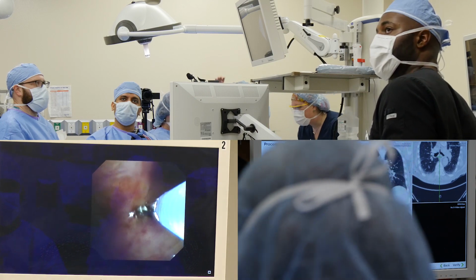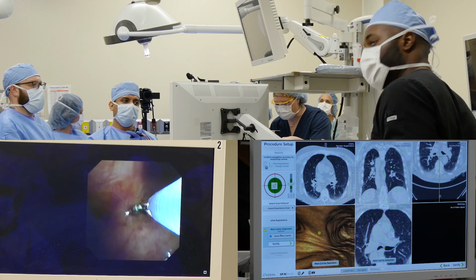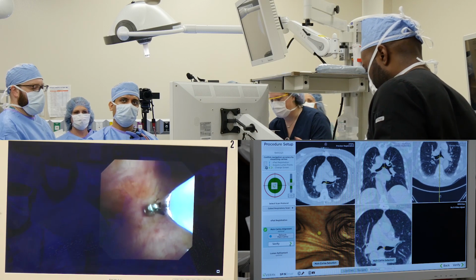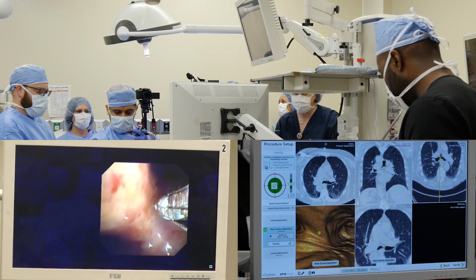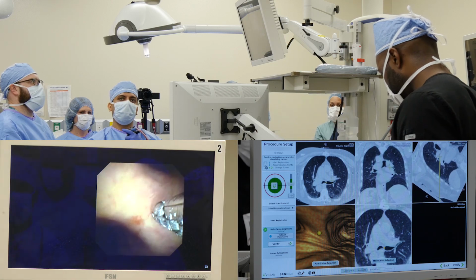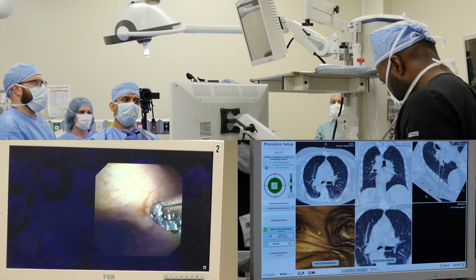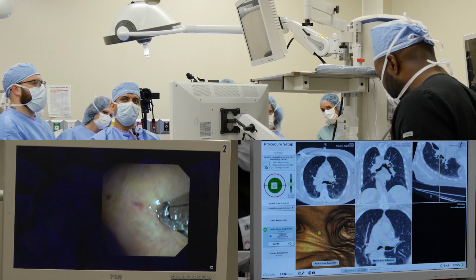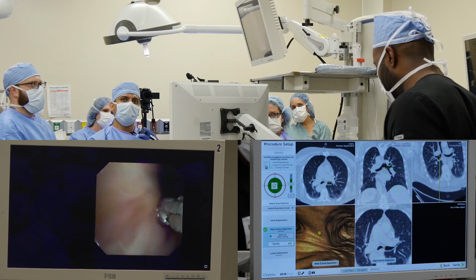Okay, that's where I am on the carina. You can see it. So right around where my mouse is, that's good. You're still there? Yeah. Okay. So you see how that's been adjusted on the scan? Okay. Let's go ahead. Okay, close it. Close it. So this is the right secondary carina. Rotate just a little bit. I'm kind of seeing it coming on the oblique. You see what I'm looking at? On the oblique and the coronal? It's not bad actually. Let's check the one on the left side as well.